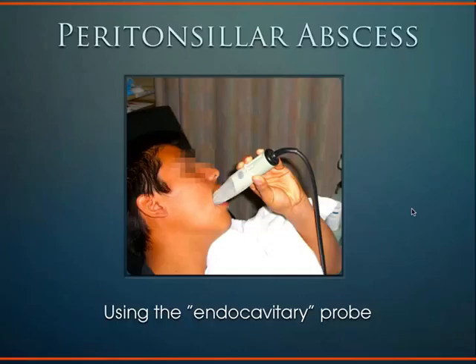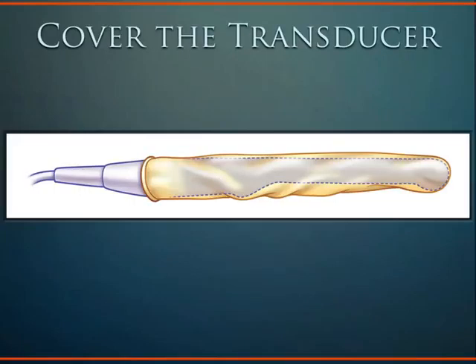There's really no good name for it. I just call it the ultrasound probe. Any other word sounds sort of suspicious. It's good to cover it with a sheath because of the other locations that the transducer can be. It's good to keep it as clean as possible using the sheath. It's good to put gel between the probe and the sheath. You could put a little gel in the sheath, and then put the transducer into the sheath so there's gel between the probe and the sheath.